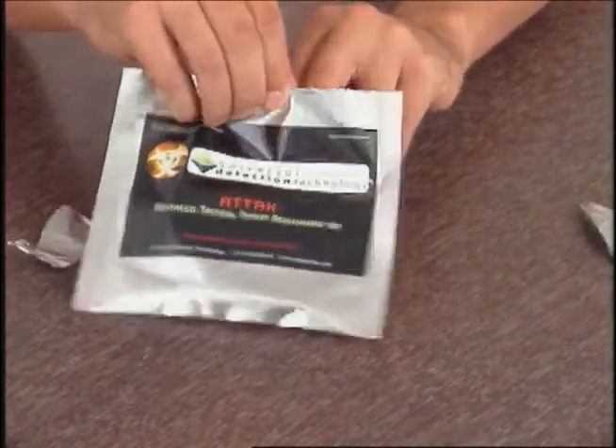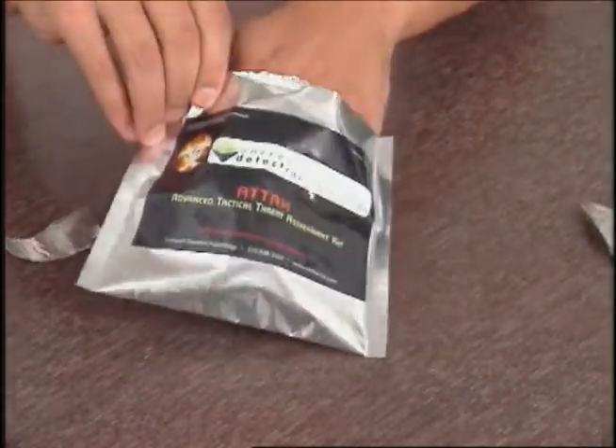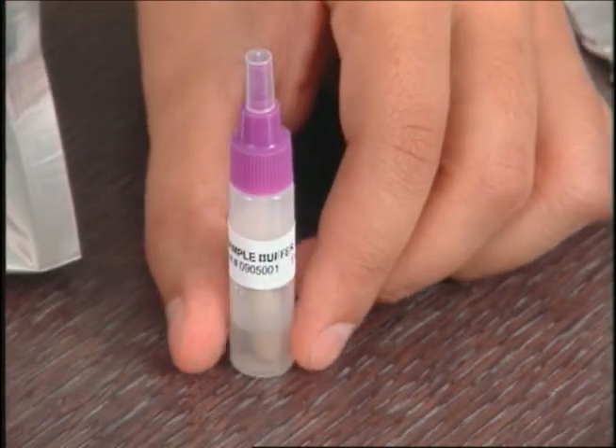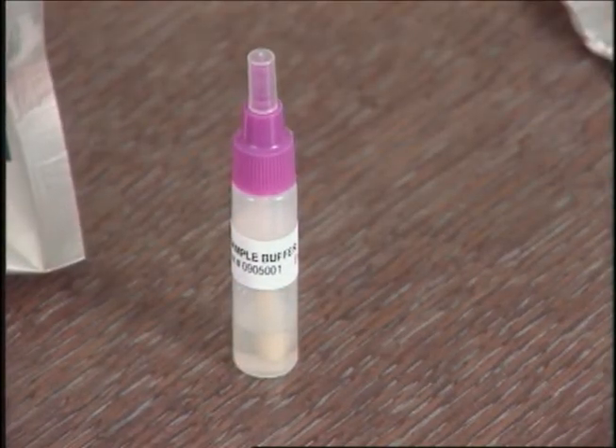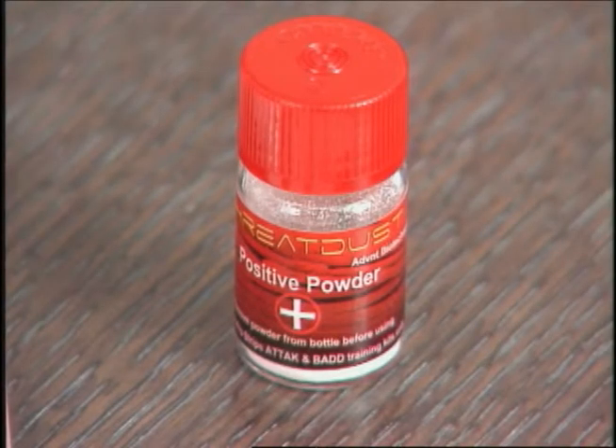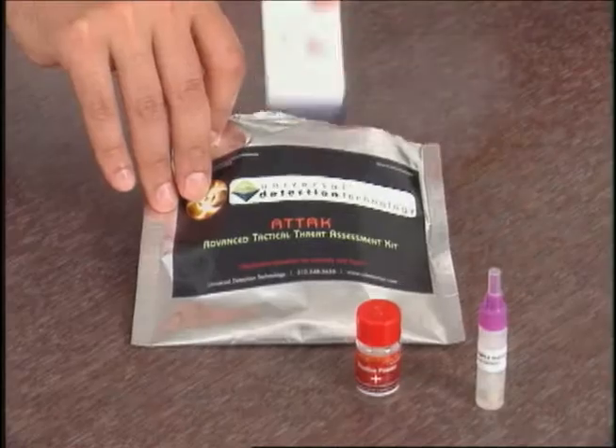Each item is designed to accurately replicate the look, feel, and function of our detection kits with suspicious powders. The simulation kits mimic the procedures used when performing a real biological weapons test in the field without exposing trainees to any harmful substances.